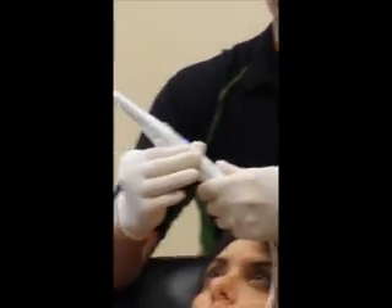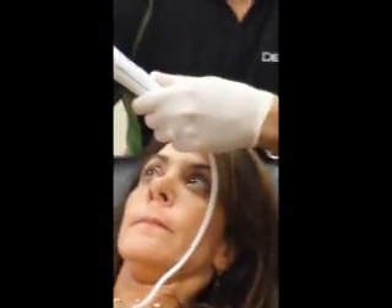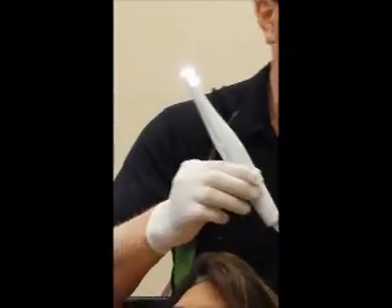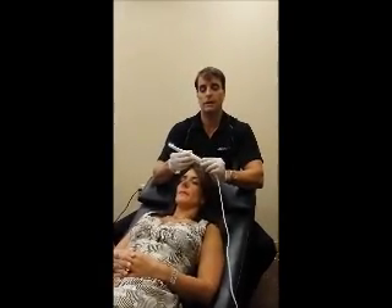The key is to always have your hands positioned properly where you can stabilize and fulcrum. Remember: align everything extra-orally with the nose, and intra-orally on the lateral. If you're at a two-to-three tooth view, you're on the opposing arch on the lateral. If you're one tooth or macro, you'll be on the same arch on the lateral. When you take the sheaths off, push them up a little bit — there's a white tab here. Work the sheath over the camera and peel it off so all the germs are inside the sheath. You can wipe the camera down — wipe the lens with alcohol, and a quick wipe with Cavicide on the body will do the trick. Avoid saturating any of the side buttons.